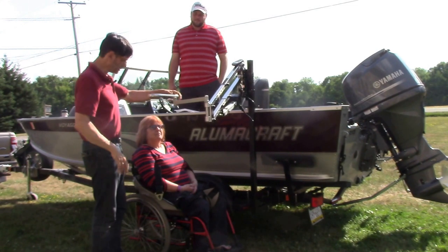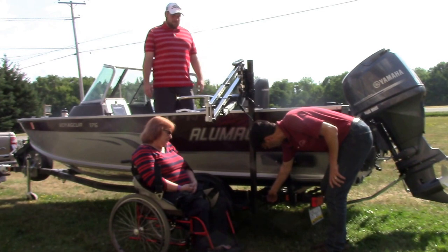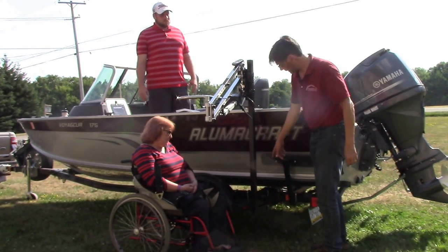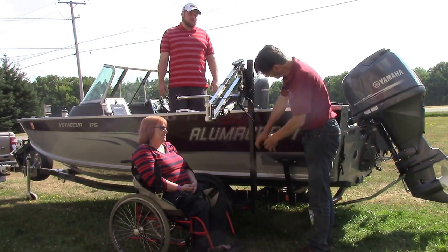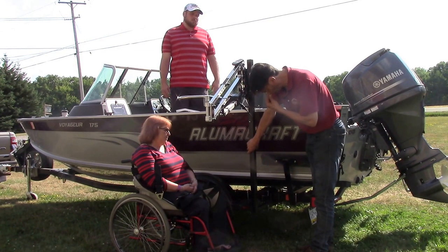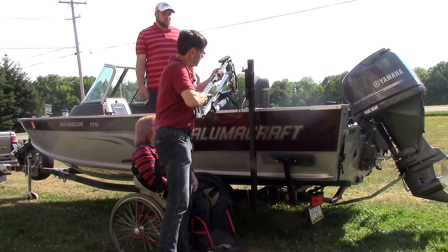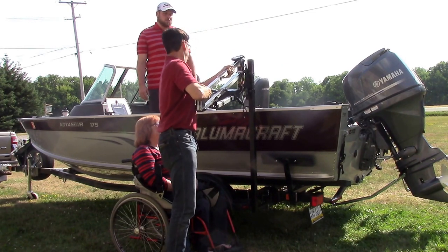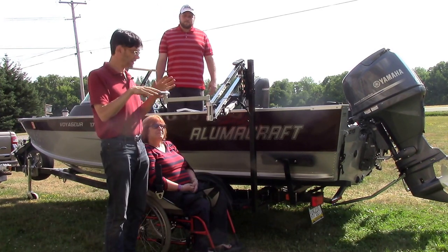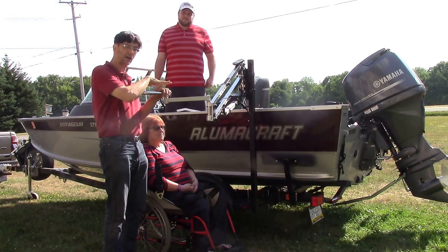How do you use the system? You'll look over here and we've got a removable pin, a set of pins, and a structure that goes across from one side of the boat to the other. You simply plug in the adapter so that you don't have anything sticking out abnormally, hook the Multilift right onto the boat adapter and you're ready to do a transfer.